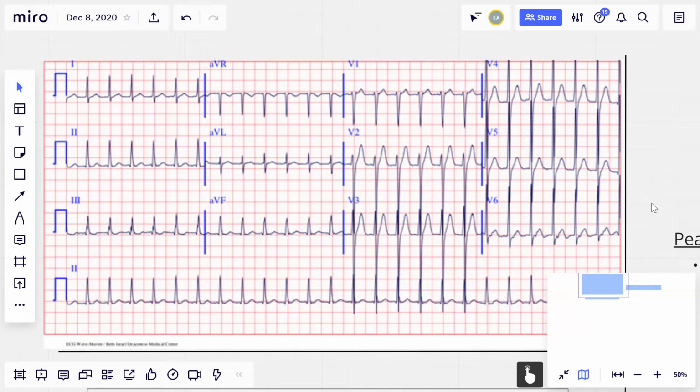But what I can immediately see is sinus tachycardia, narrow complex, and hyperacute T waves within V2 to V4, which for me would be consistent with a possible arrhythmia located above the ventricles, either within the atria or the His bundle. And the hyperacute T waves could be indicative of acute ischemia.